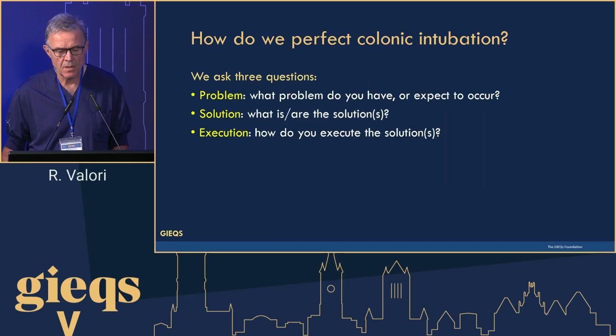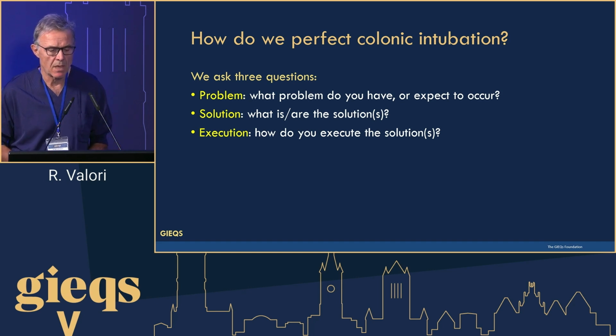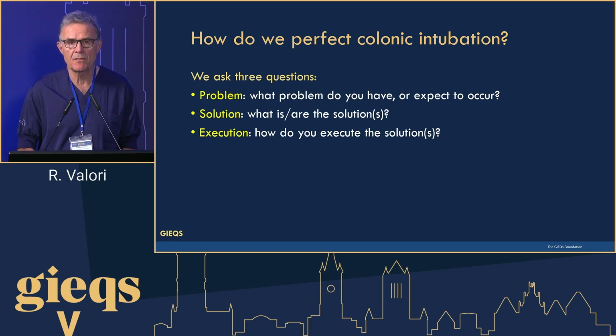And I think the first thing I'll say is that if we want to perfect our colonic intubation, we need to ask ourselves three questions. What problem do you have if you're not progressing? Or what problem do you expect to occur?